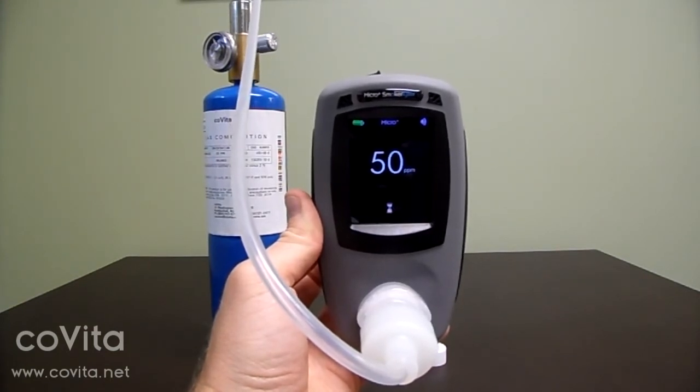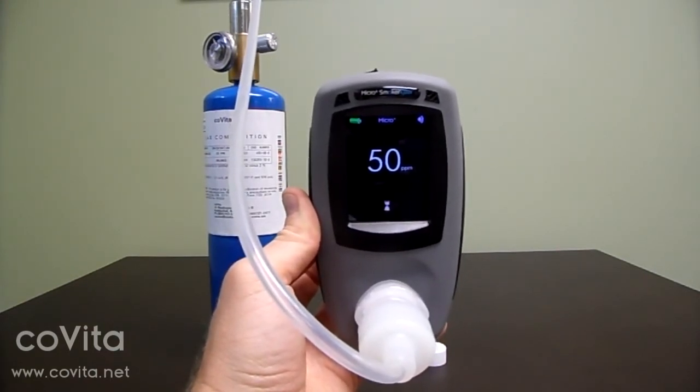Allow the gas to flow and don't worry about the number you see on the screen. Calibration is complete when you've received a check mark or an X on the screen. If you receive an X on the screen, restart the calibration process.